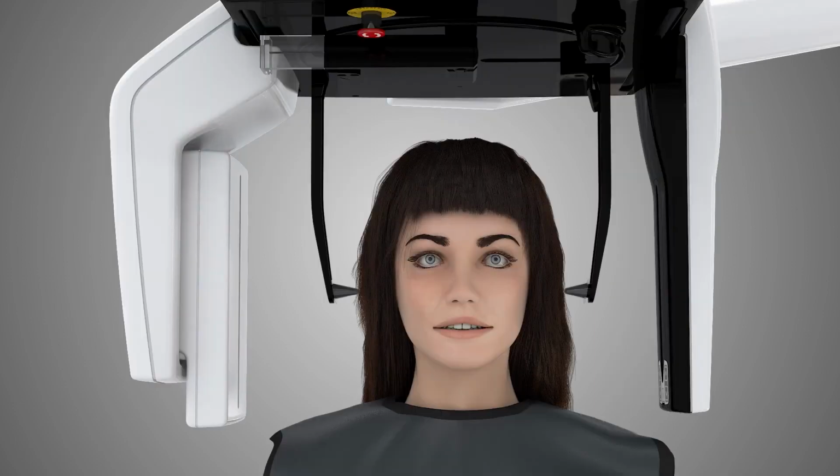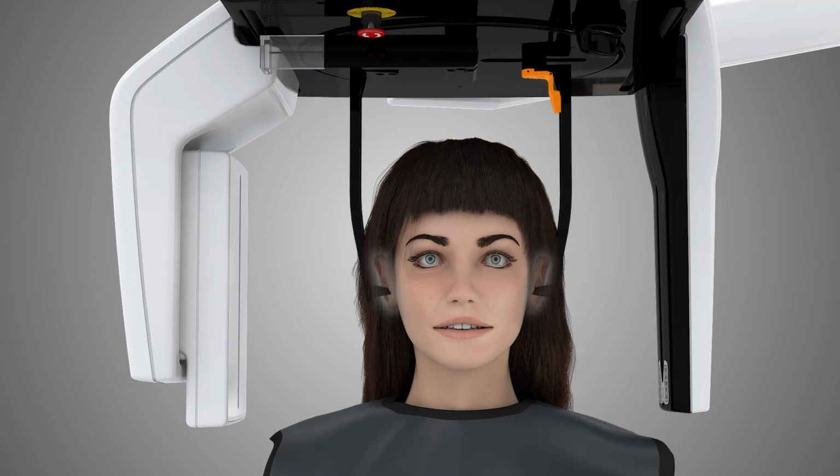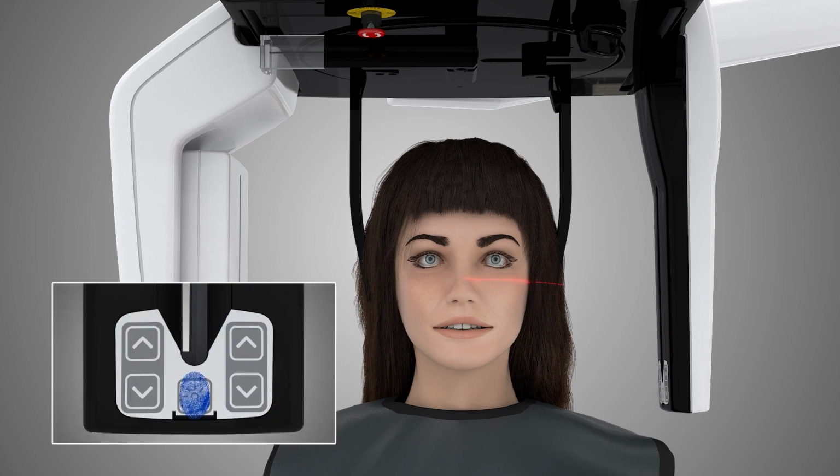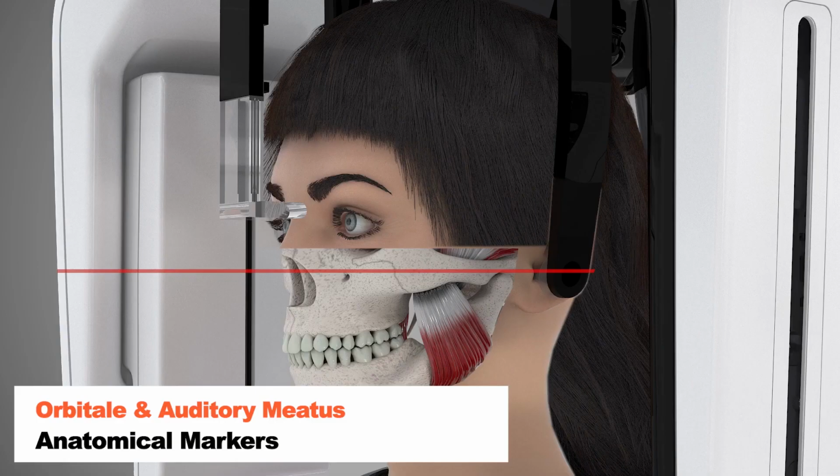Guide the patient into the unit. Move the ear rods towards the patient's ears by pressing the ear rod brake button and sliding the ear rods into position. Press the laser light button on the patient positioning panel. Adjust the Frankfurt horizontal plane laser by manually tilting the patient's chin up or down as needed. The light must be parallel to the porion, from the lower orbit of the eye, or orbitale, to the upper margin of the ear canal, or external auditory meatus.